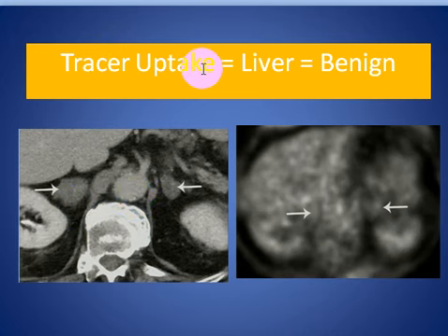If the tracer uptake is almost equal to the liver, most likely it is a benign lesion.